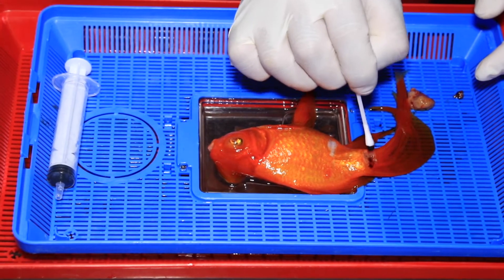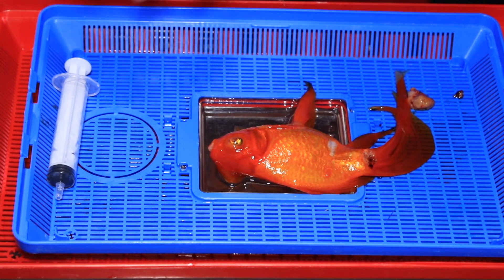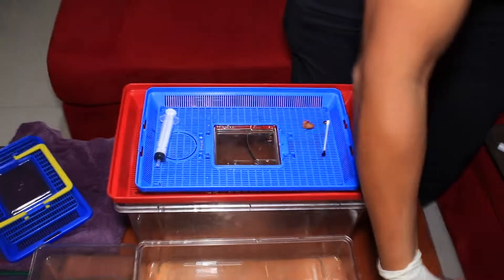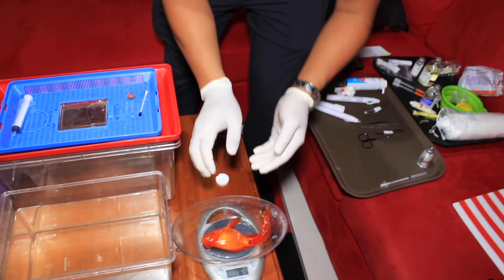There's a brief discussion about the tissue appearance — it should be red tissue right there. The owner asks whether it may grow back, and Dr. Menlo notes it possibly may, but the freeze was applied to target the deeper tissues.